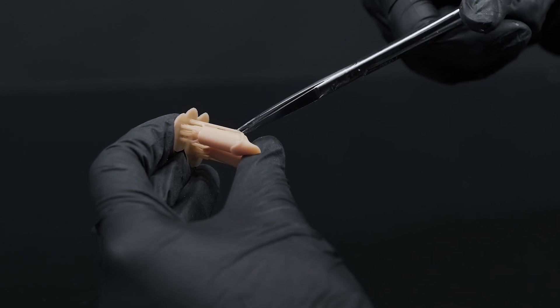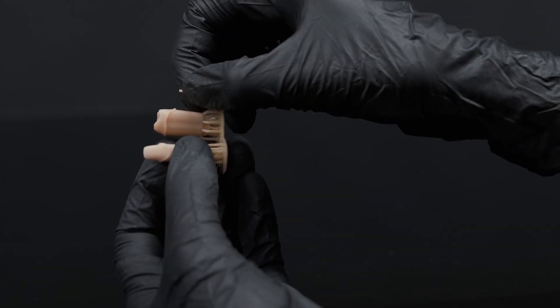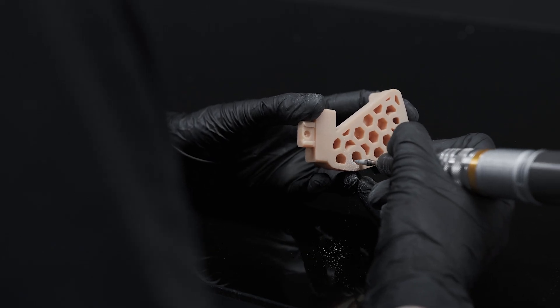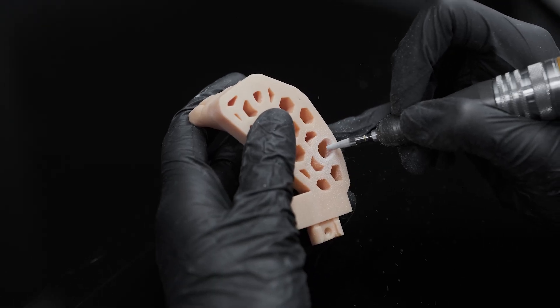To take the supports off, you can use scissors, just your fingers, or a scalpel. Then, using a burr, finish the housing of the die to remove excess resin caused by the bottom layers.